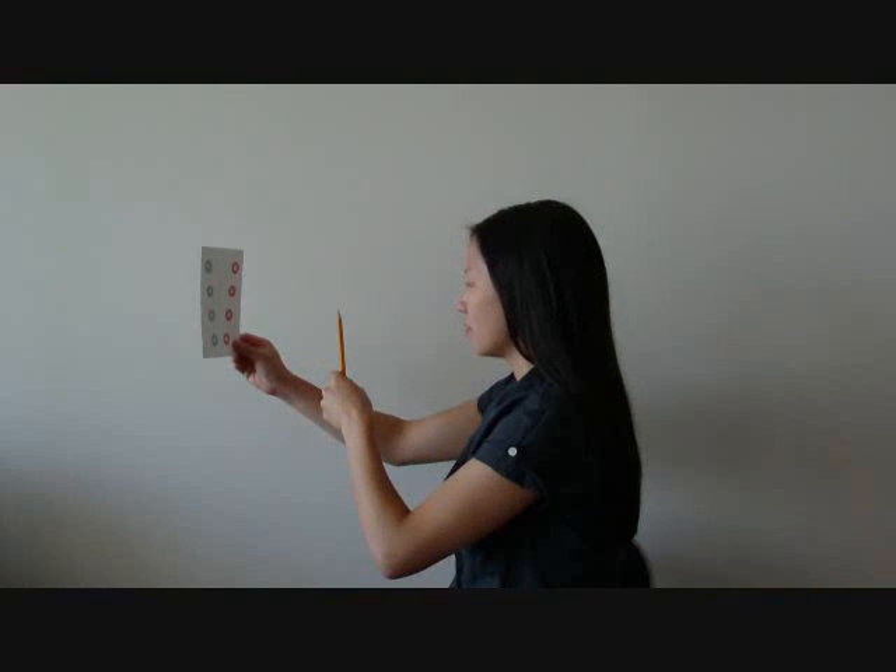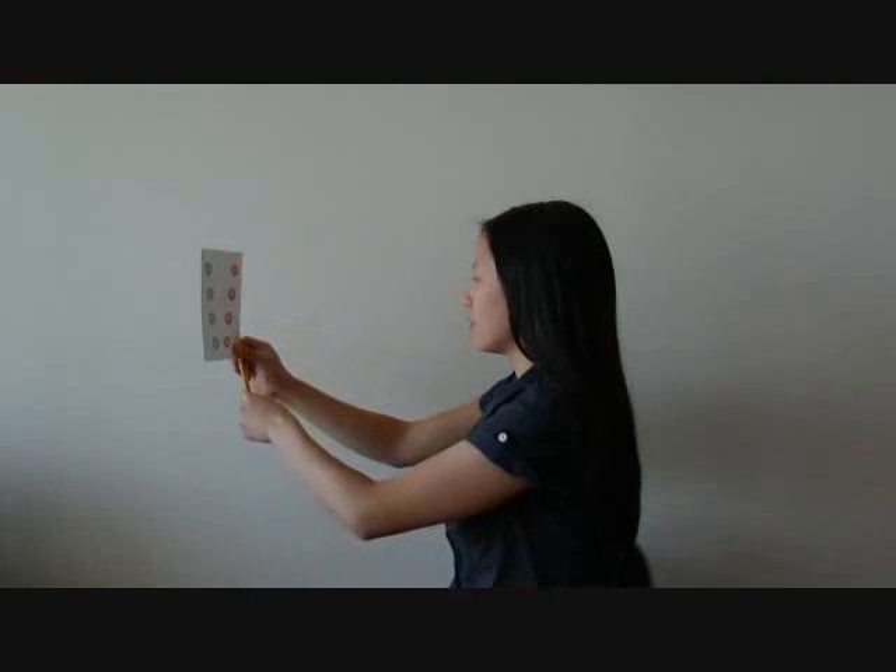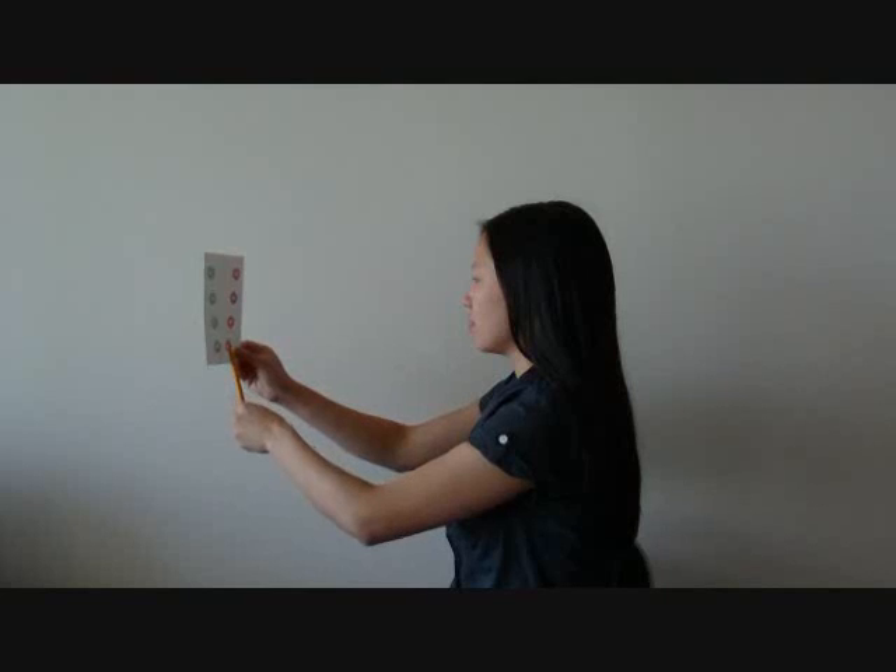If you do not see the proper three circles, start over again. Push the pencil towards the Lifesaver card, then slowly bring the pencil towards yourself.